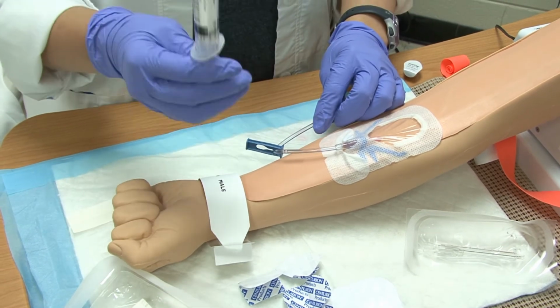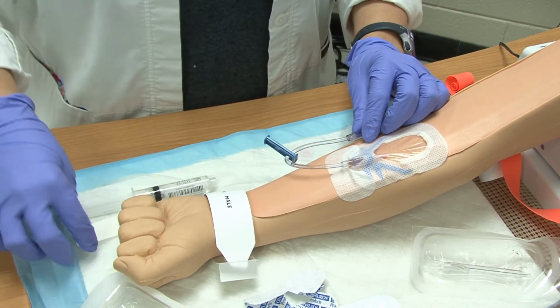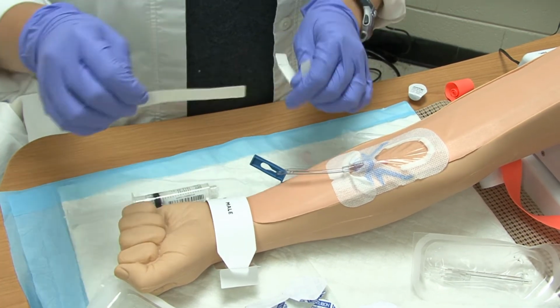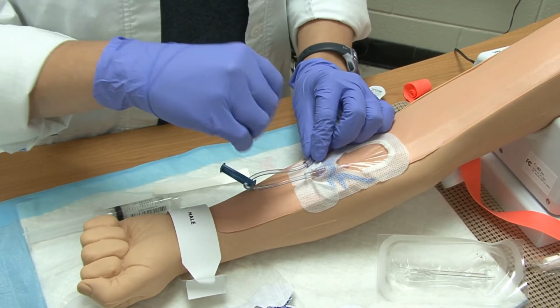Once I have taken this off, I cannot reuse it. You need to remember that. It takes a new flush every time. Then I can come back down and I can take another one of the little securement devices, and I can come and I can secure this.